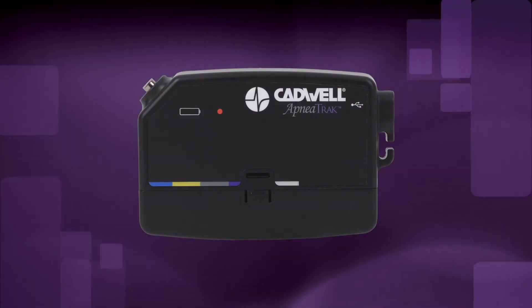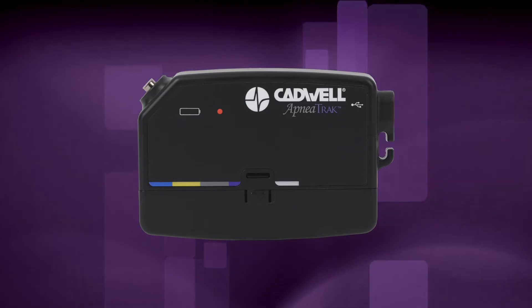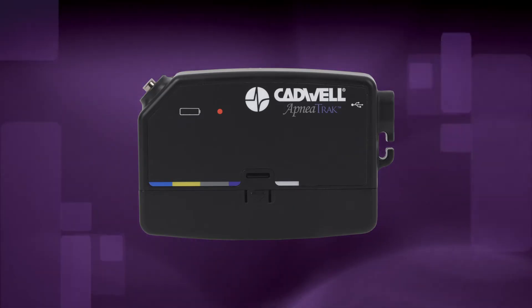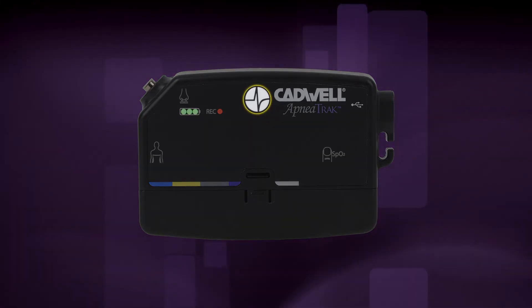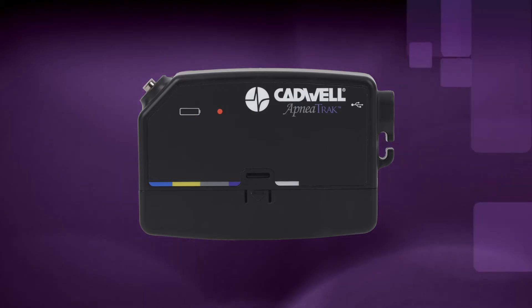To record an event for review, press the raised Cadwell logo event button once to mark an event in your sleep study data. Write down the time and the reason of the event for your physician to review. To check if the device is recording at any time, push the event button and the recording LED will illuminate for a few seconds. If you feel uncomfortable, you can move the apnea track to either side of your chest, but please leave it on the front of your body to correctly record your body position during sleep.